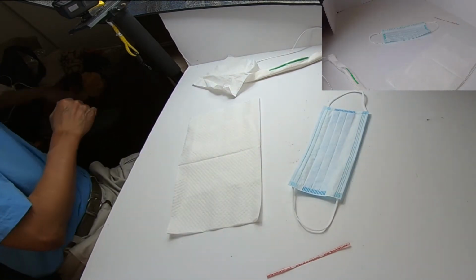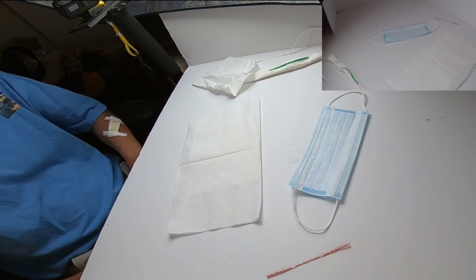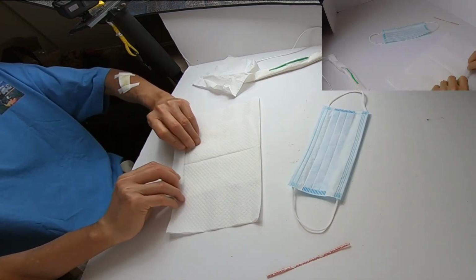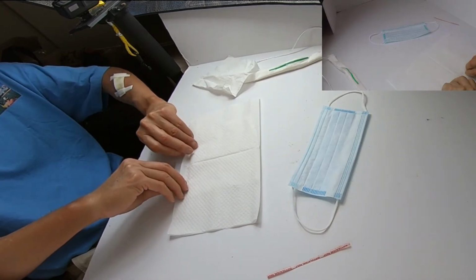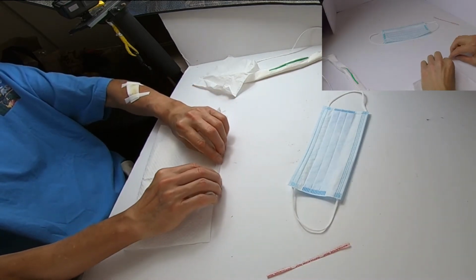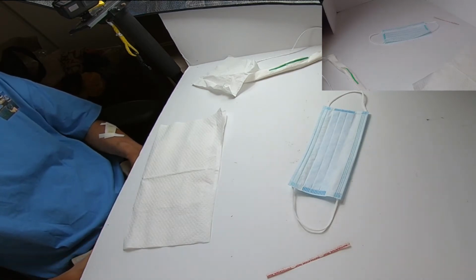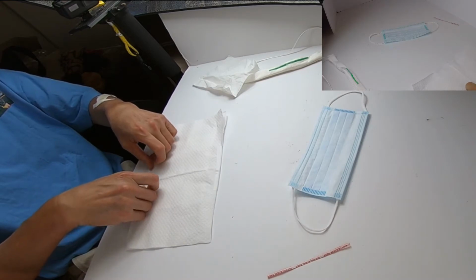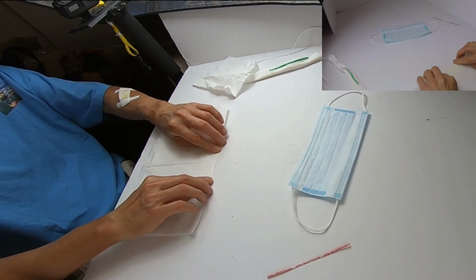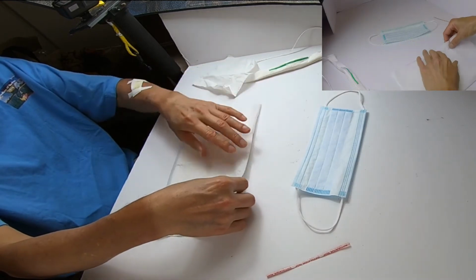Now I'm going to get some tape, and I'll be putting some tape on the open end here. Just run along the edge, like so. Then you fold it down, like so, and that stops that edge. I would also put one on the bottom as well, and you'll see what this is for at the end, even though this end is closed. I would then seal it. So now you have one that is half a napkin and sealed.